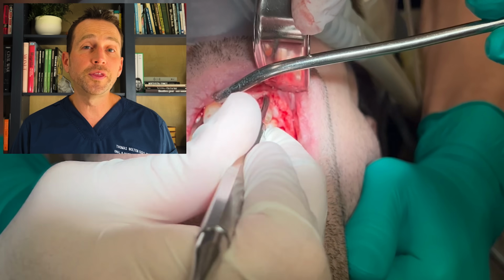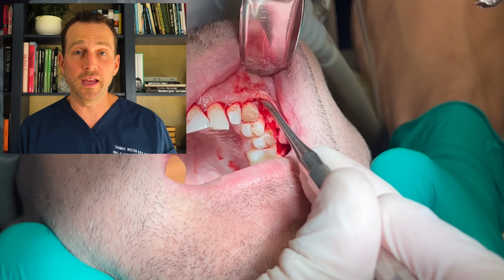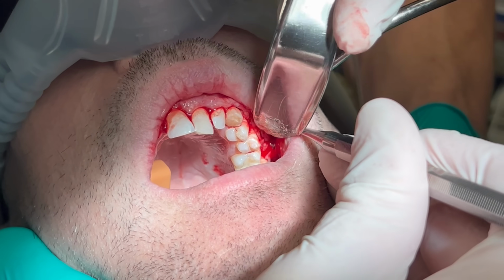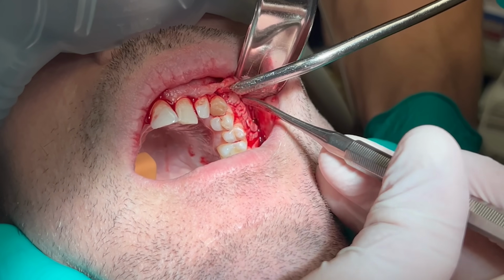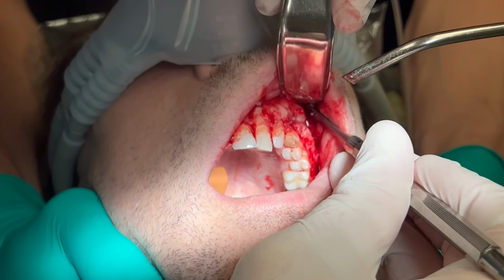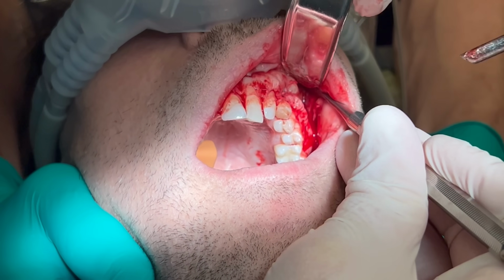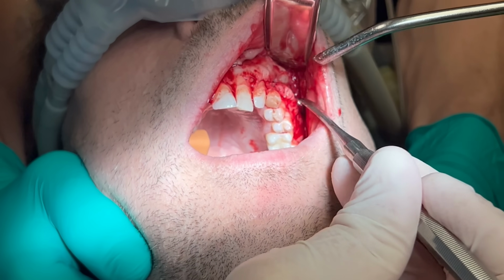I elevate a full thickness mucoperiosteal flap and identify the location of the canine. Next, I use a round burr to uncover the canine.